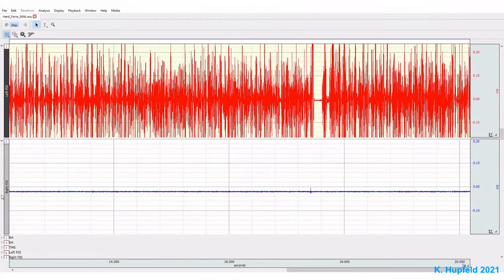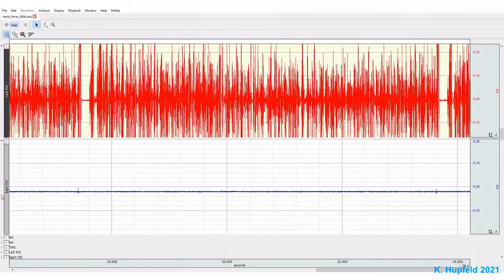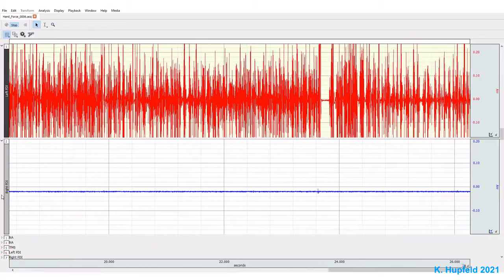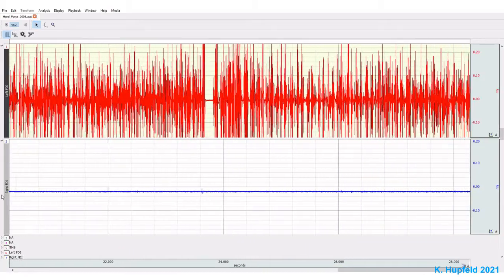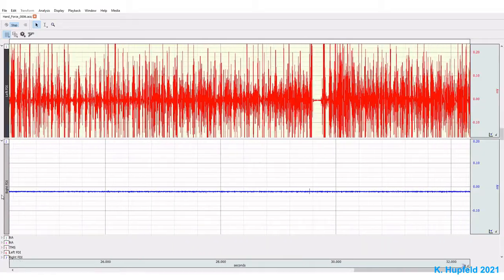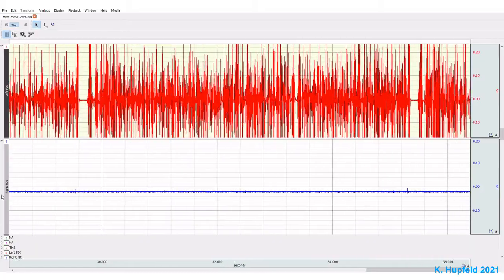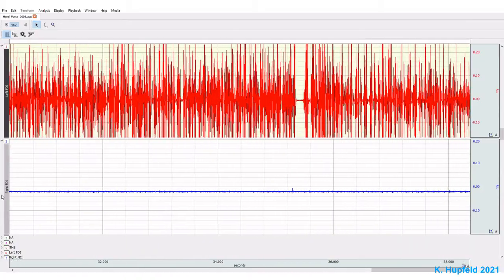A cSP presents as a reduction or silence of ongoing muscle activity during a voluntary muscle contraction and provides information regarding intracortical inhibition. cSPs thus give us insight into how the central nervous system controls muscle activity and the role of inhibition in the neural control of movement.